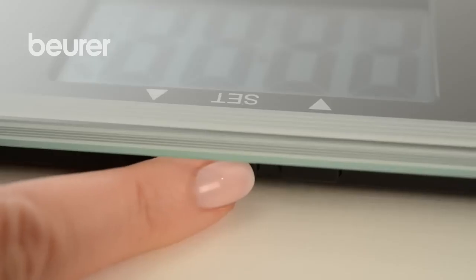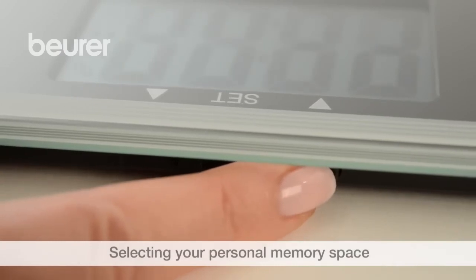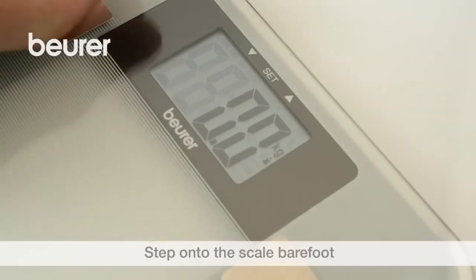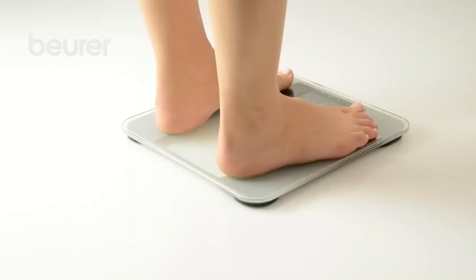Proceed as follows for diagnostic measurements. Press the Set button, then select your personal memory space using the arrow button. Wait until 0.0 is displayed. Then step onto the scale with your bare feet. Stand still in the center between both electrodes, then step off the scale.